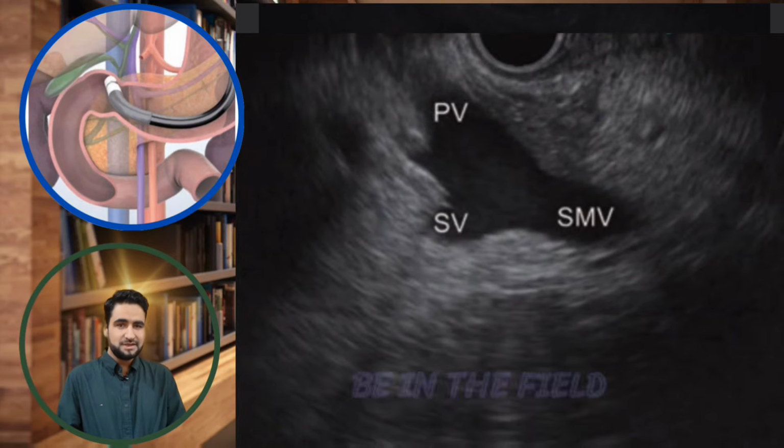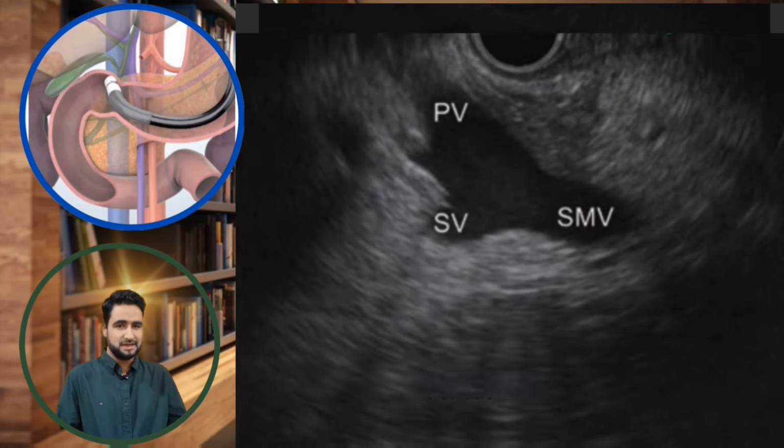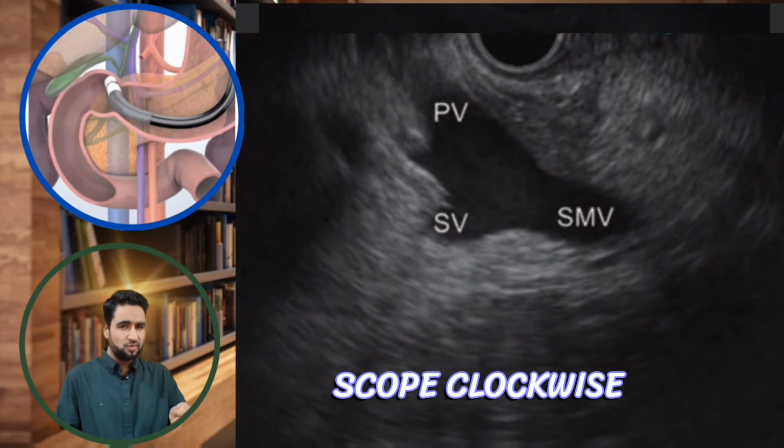Splenic vein will be in the field range of central beam and it will be displayed in the center as a branch. You will keep on rotating your scope clockwise.